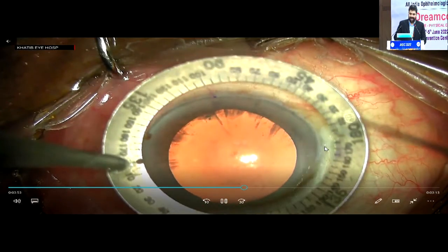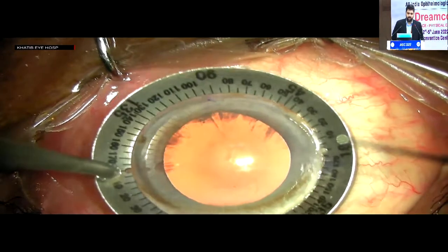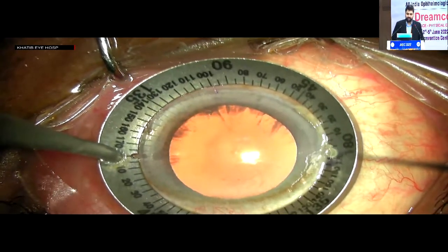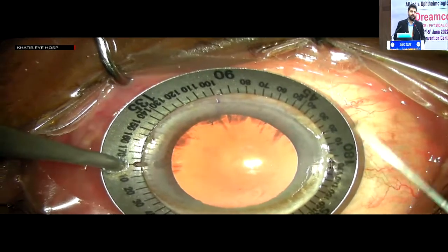So after you dry the area well, now I've got a single freehand mark which is at 100 degrees, which I've confirmed with my smartphone. So I'll keep my Mendes ring. It's important to dry the cornea well before you put the Mendes ring. I keep the Mendes ring at 100 degrees, and now my IOL has to be at 20 degrees.